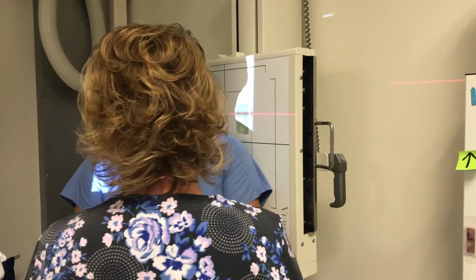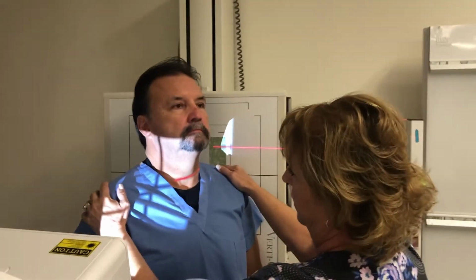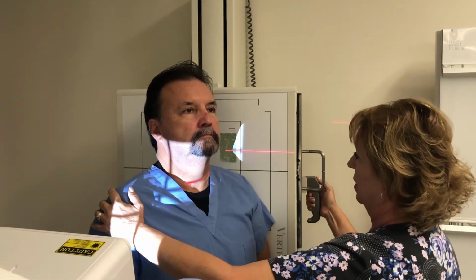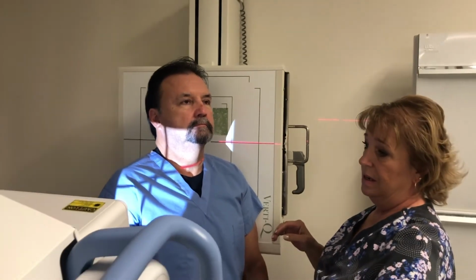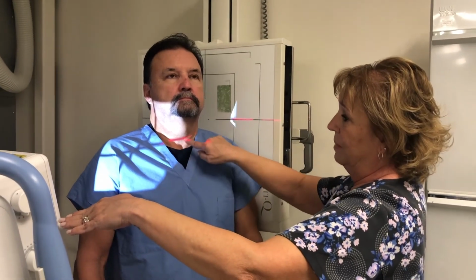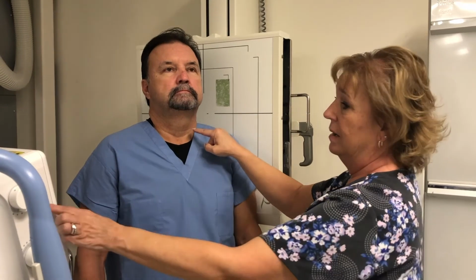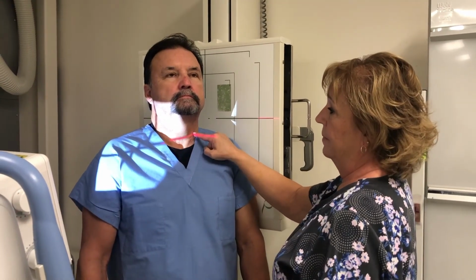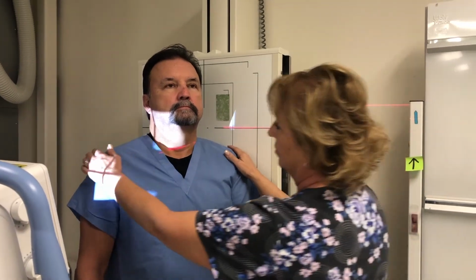Place your arms along your side for me. Come forward just a little bit. Okay. Now you have to compensate for the angulation. So it looks like I'm starting really low, but by the time it's actually passing through at the level of his spine, I'm at C4. And then it comes up, and so I adjust my bucky.